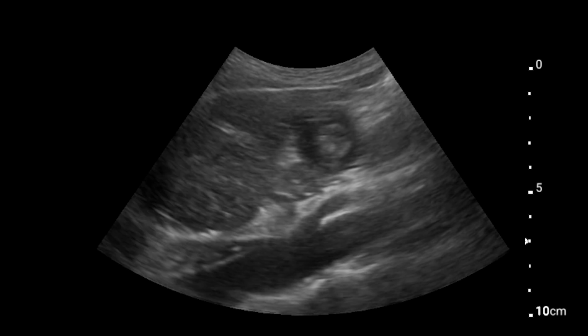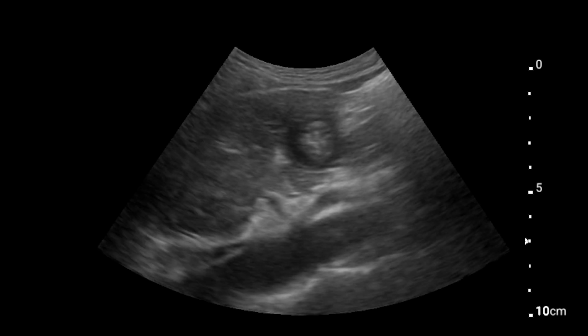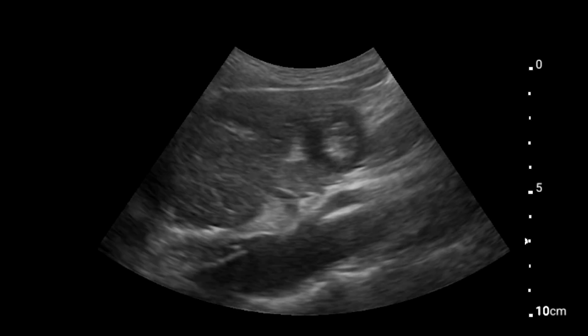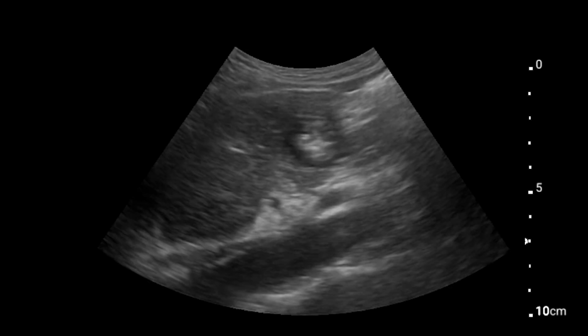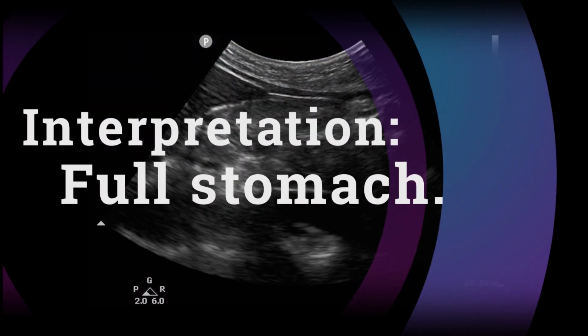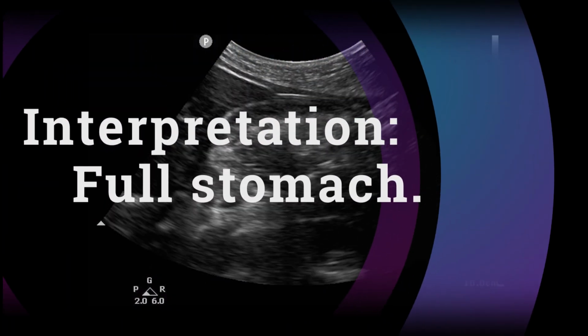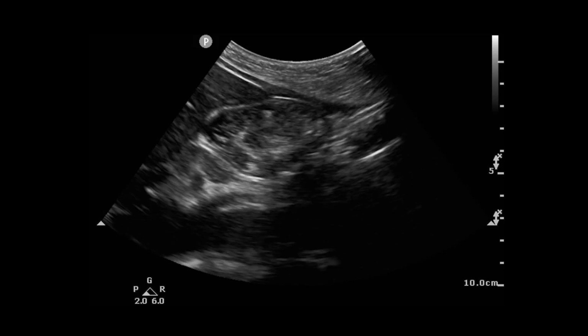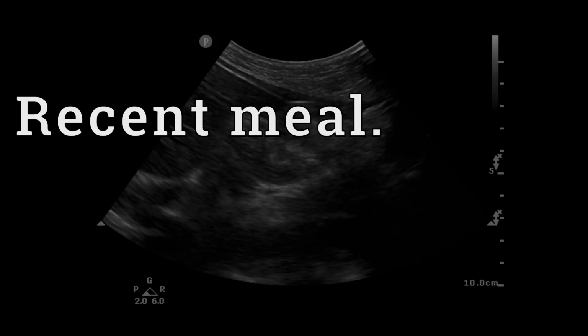The gastric antrum wall layers appear thick, with both the anterior and posterior walls being in close proximity to each other. The gastric antrum has a round or oval shape and has a target or bullseye pattern. Full stomach. Let's say you decide to take a bite out of your favorite meal while enjoying this amazing lecture. Despite there being a wide variety of meals, gastric ultrasound has very distinct features.